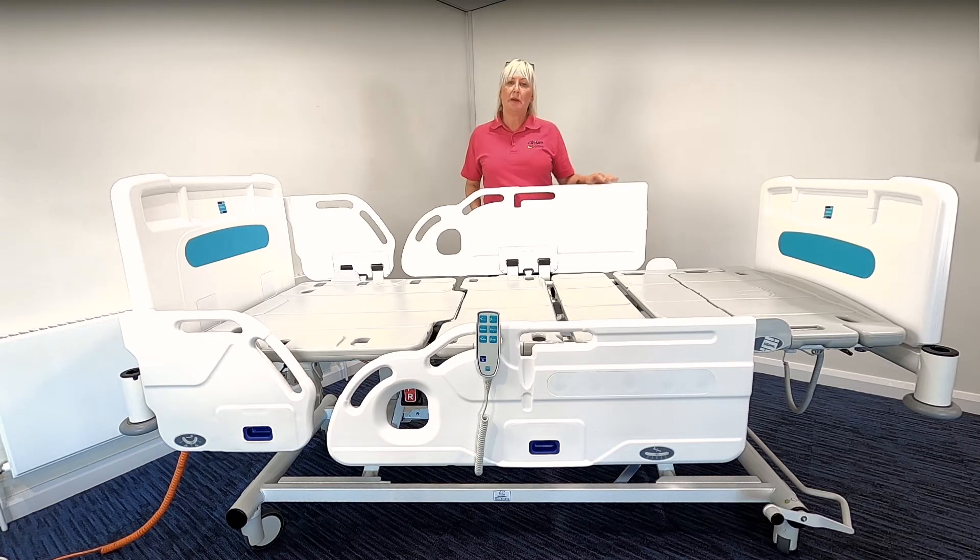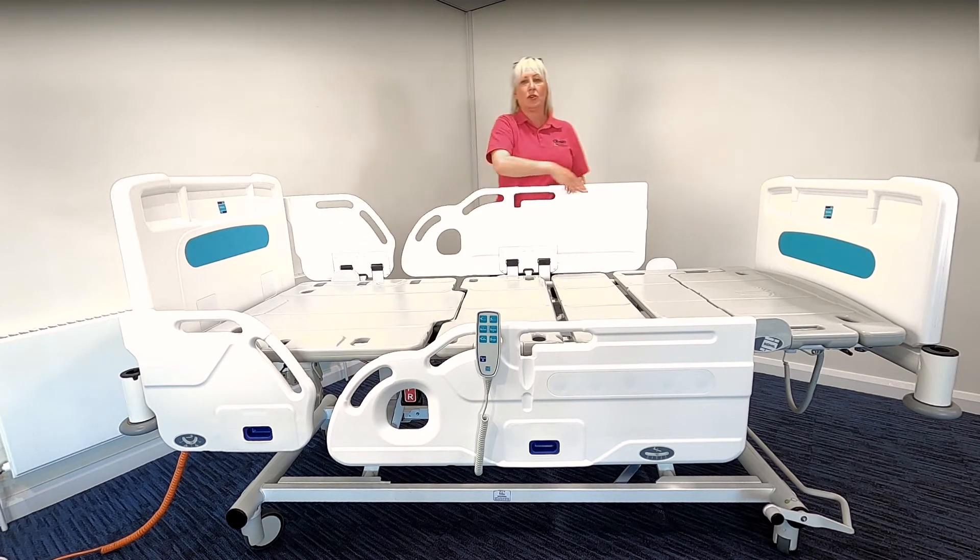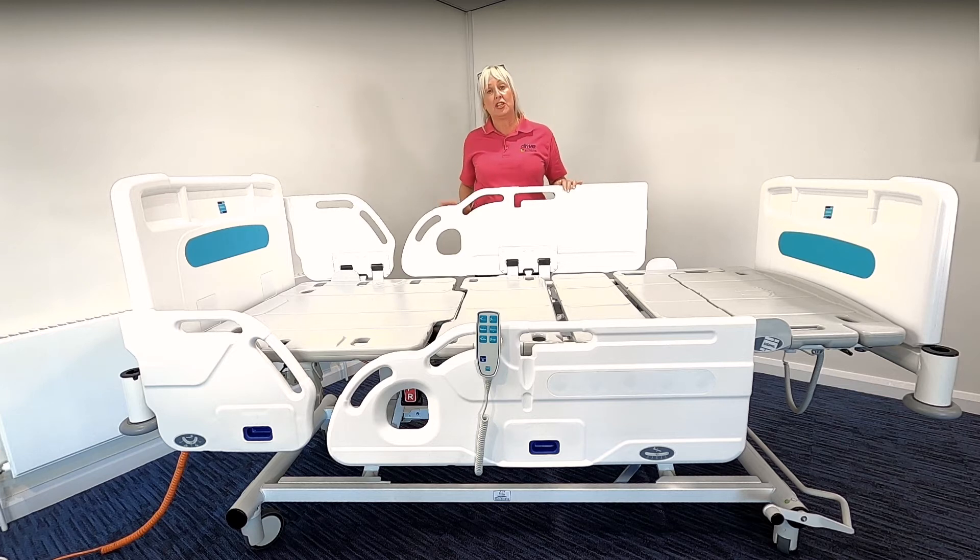The bed platform is designed to be compatible with a wide range of mattresses, both foam and dynamic. It has mattress retainers at the four corners for correct positioning of static mattresses and it also has strapping points on the mattress platform for the use of dynamic mattresses. It's very important to ensure when you do use a mattress with straps that you only connect it to the moving parts of the bed.